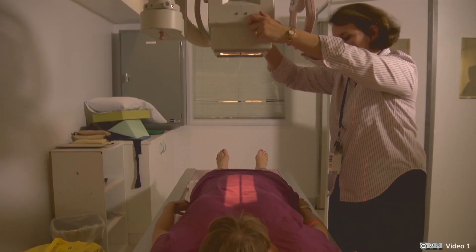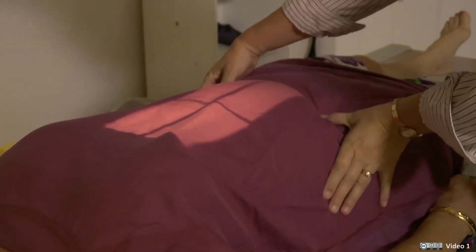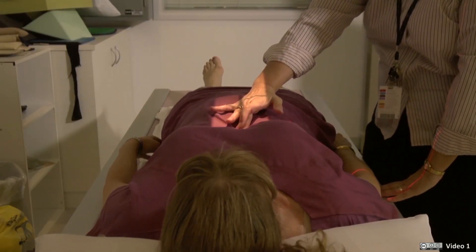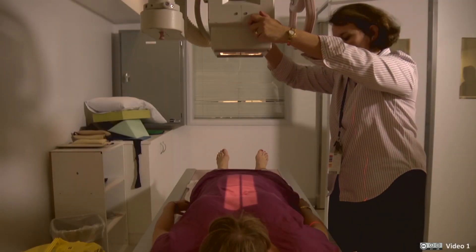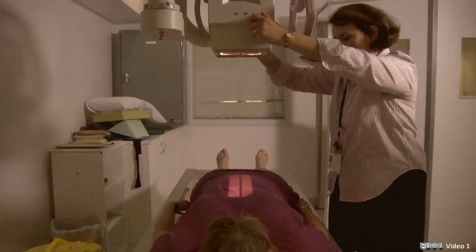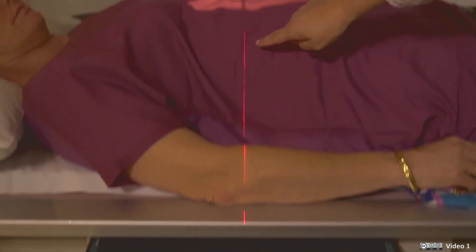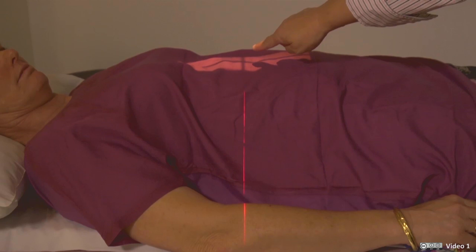In this case, a lumbar spine x-ray. A light in the unit simulates where the x-ray beam will fall, and the radiographer will feel for anatomical landmarks to centre the patient to the correct position. The light beam diaphragm is then adjusted to a narrow section extending from the ribs to the pelvis. A laser is used to ensure that the centre of the desired field of view is exactly aligned with the centre of the detector system.